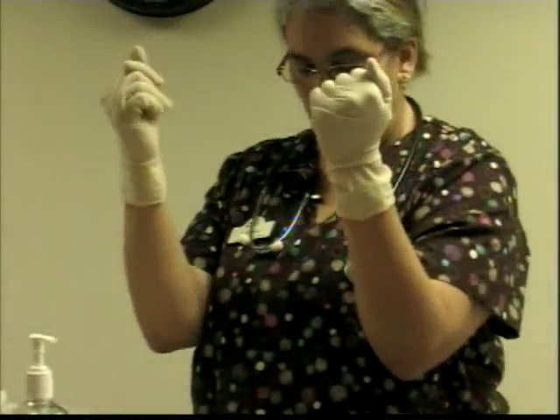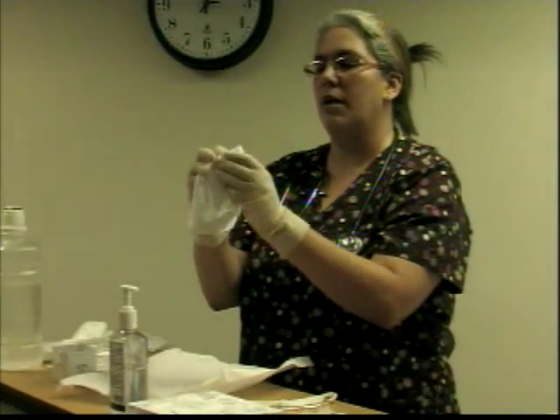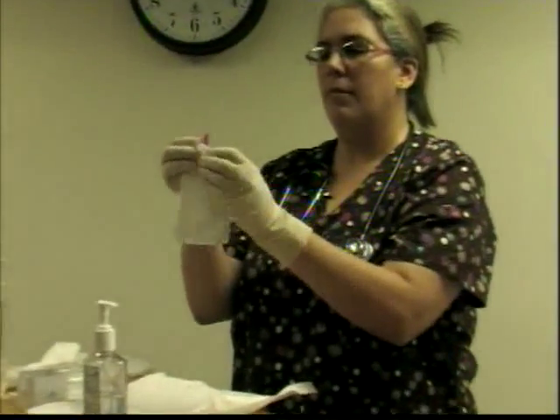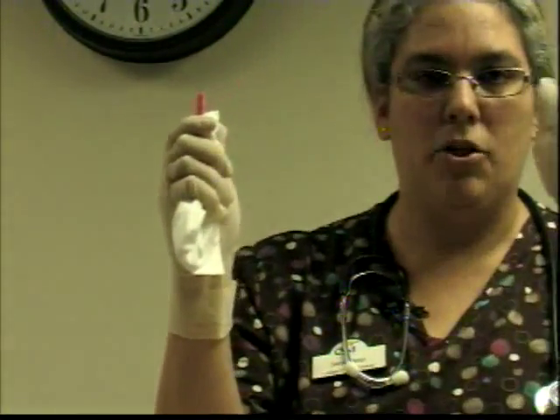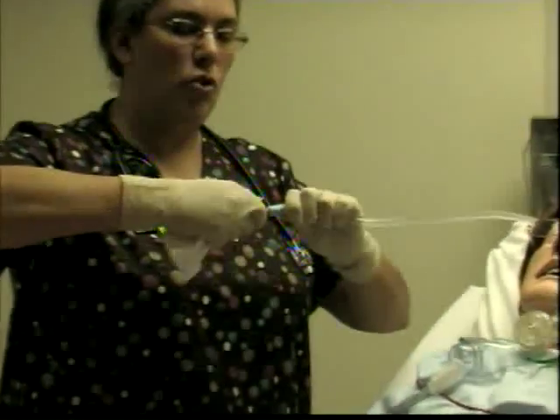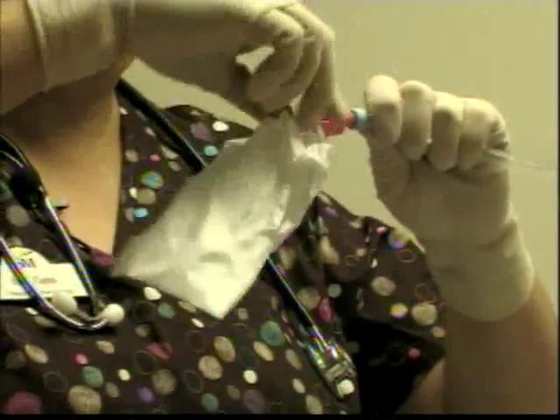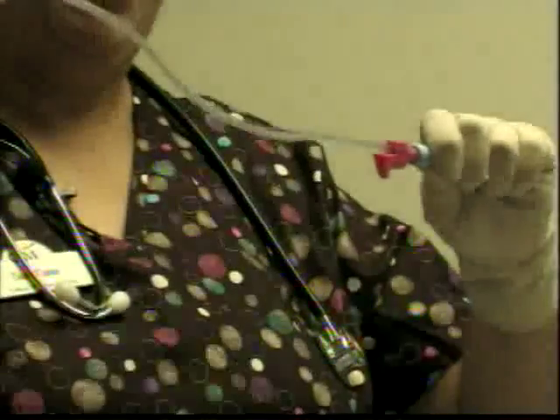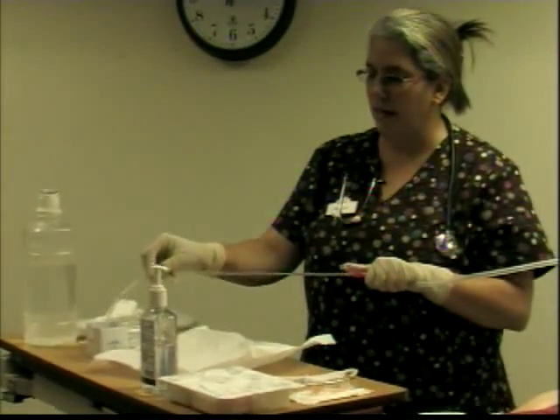You're still sterile above your waist. You grab your packet and you make sure that you expose the connector. And now my dominant hand, my sterile hand, is going to be my right hand. My dirty hand is going to be my left hand. So I grab now my suction. I will make a connection, making sure that I don't touch both hands or the connector with the other hand. And then I will remove the packet. At the same time, I'm making sure that it doesn't get dirty. I'll check my suction, and you see, you clean a little bit of that catheter.